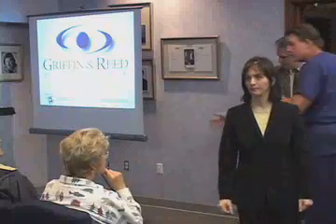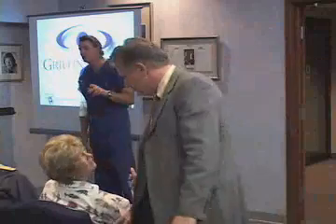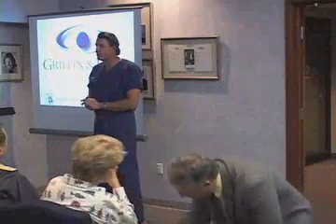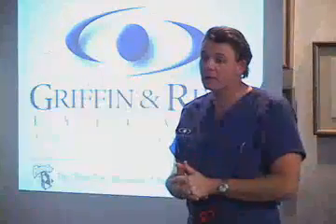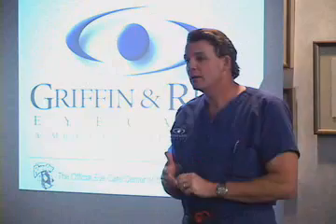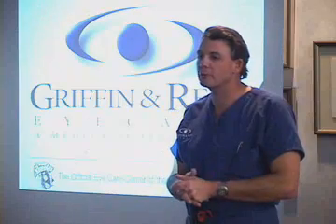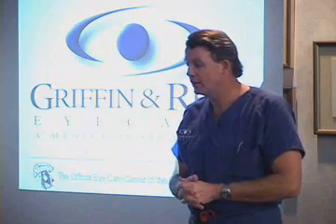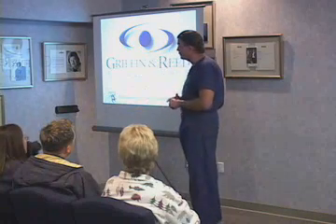Video of the actual surgery on one of Kev's eyes, okay? When we evaluate folks, about 5% of the people that come into the office to get evaluated are not candidates for the surgery. As a result of that, that's the reason for the contact lens thing, and that's the reason to come in wearing your lenses unless you're absolutely positive you're a good candidate. I'm not sure how you'd be positive of that unless you'd had a 3.5 hour evaluation already.